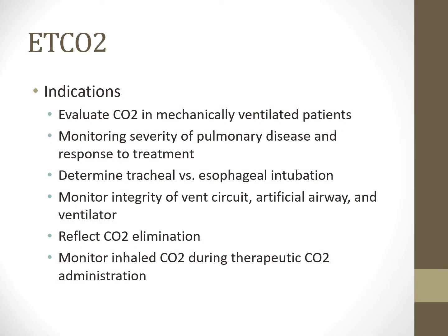Indications for end-tidal CO2. I obviously have a bias towards it, so I'm going to have a very light trigger to initiate it. But evaluation of CO2 in mechanically ventilated patients. This is a great way to see if their dead space issues are getting better or worse.